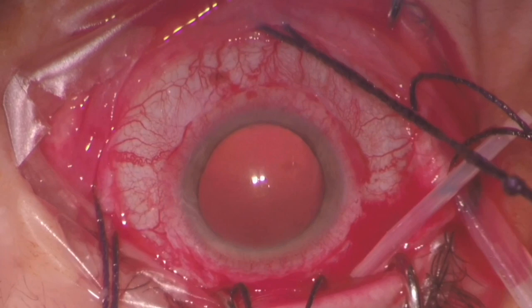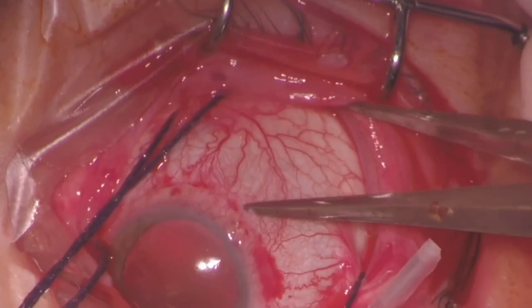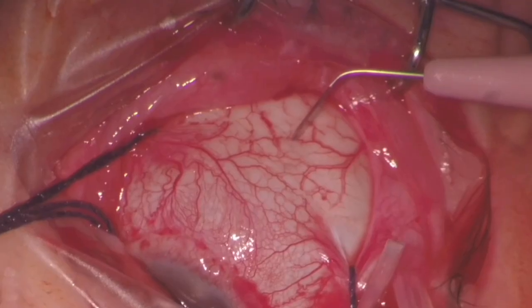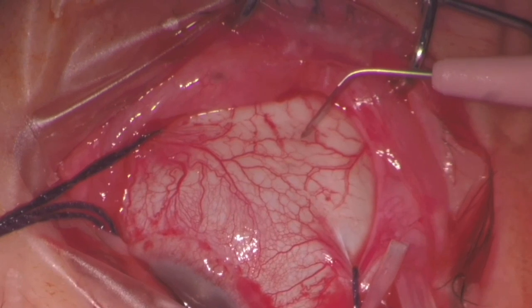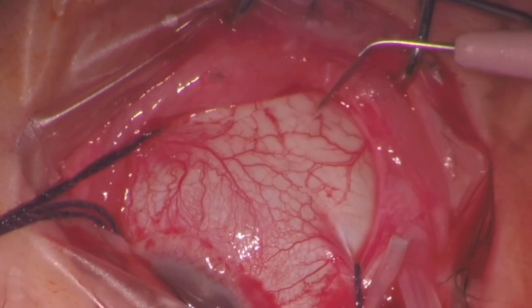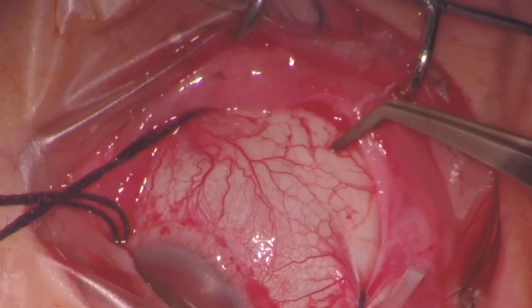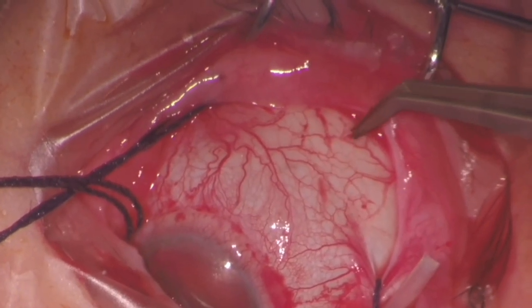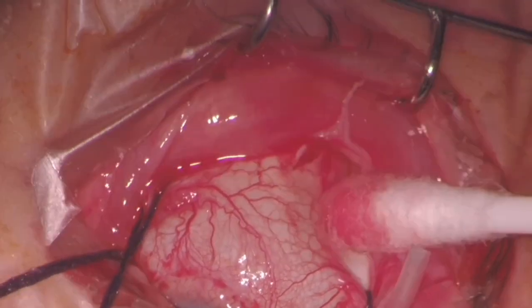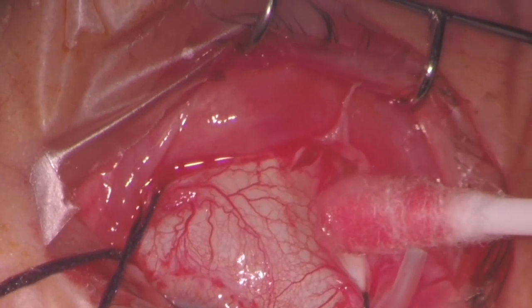The anatomy of this patient's orbit did not allow drainage to be performed in the nasal quadrant. So the surgeon makes a linear incision in the inferotemporal quadrant in the location previously marked to be in the retinal break position to drain the subretinal fluid. The chosen site was inspected and drainage close to the inferior rectus muscle was avoided due to the proximity of the vortex vein. After dissection until the uveal tissue was visualized, cauterization and drainage were performed using the vectis needle.